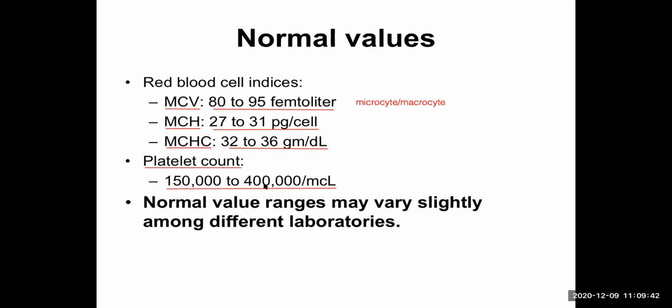This lakh is a unit which is not used universally all over the world. It is very commonly used in the Asian subcontinent, or Indian subcontinent, I should say. So it is better to remember it as 150,000 to 400,000 per microliter. So this is the platelet count.